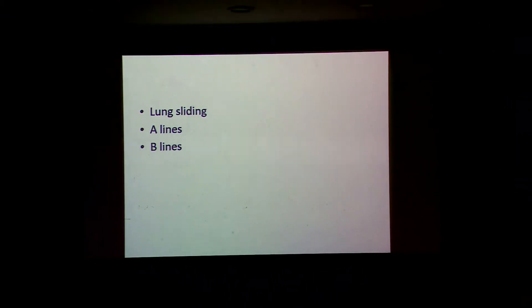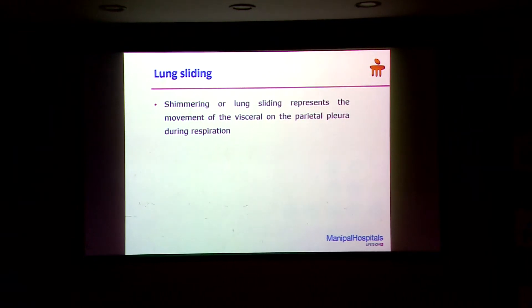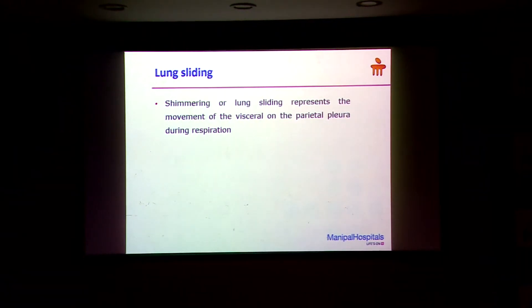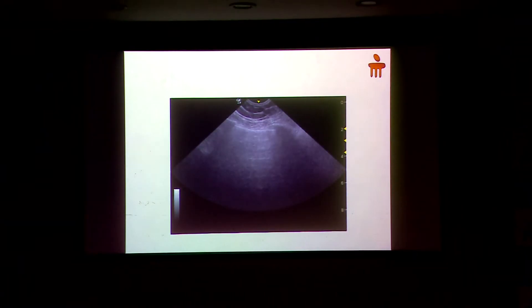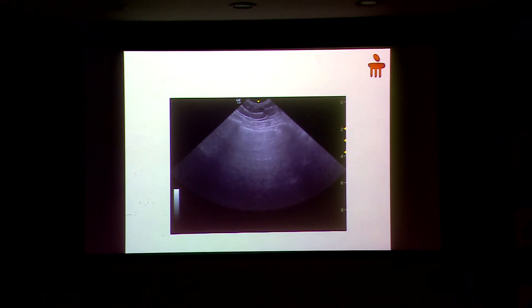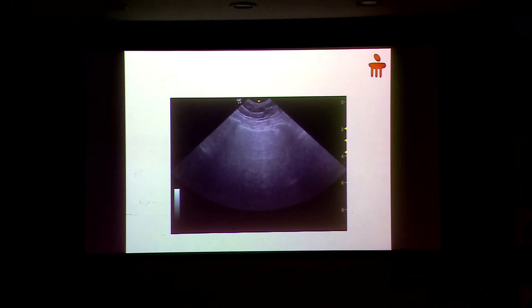There are a few terminal analogies you will have to understand. One is called lung sliding, another one is called A-line, and another one is called B-line. Lung sliding is basically a shimmering you see. That shimmering is the pleural slide — it means the parietal and visceral pleura are very close to each other. There is no pneumothorax or anything keeping them apart, and they are moving during inspiration and expiration.